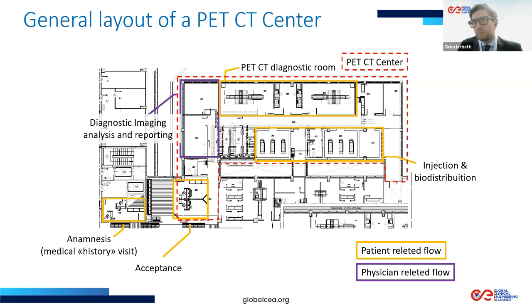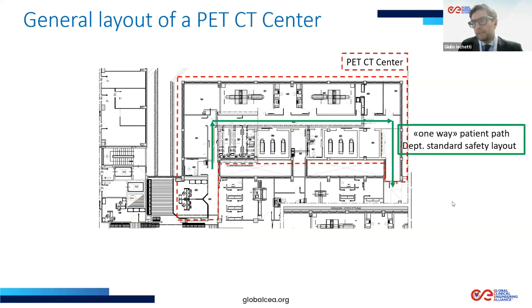I would underline a principle in the layout: the one-way patient path is very important. The principle is that the patient never has to step back from the entrance to the exit of the department.